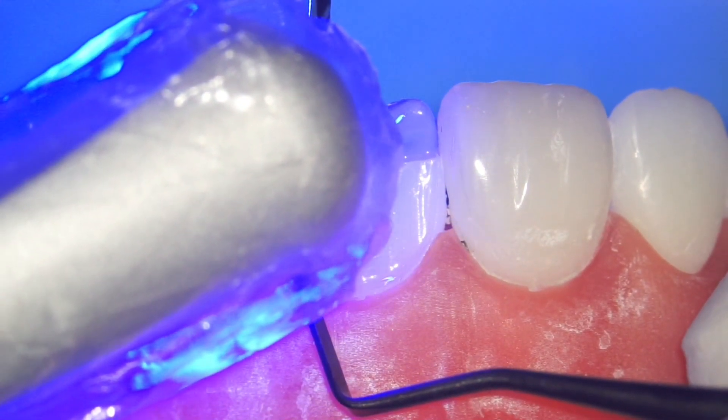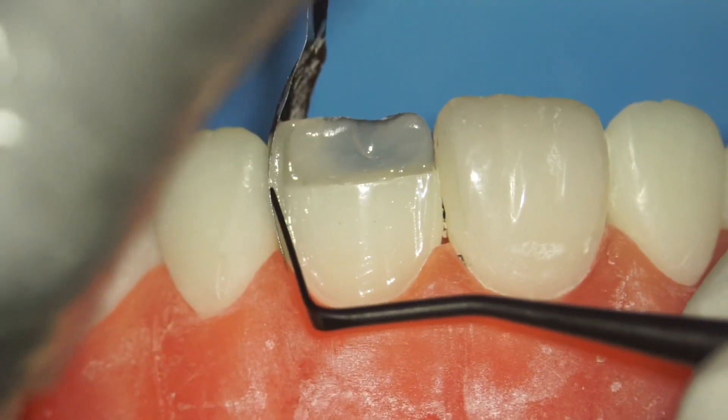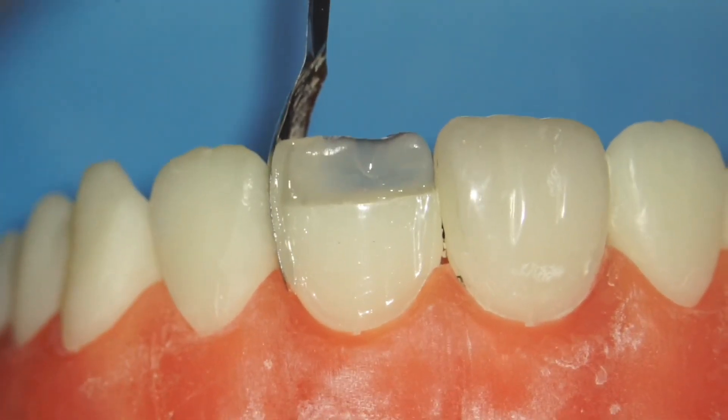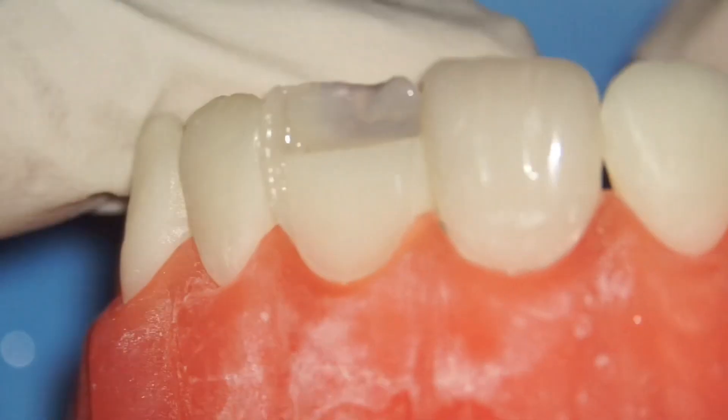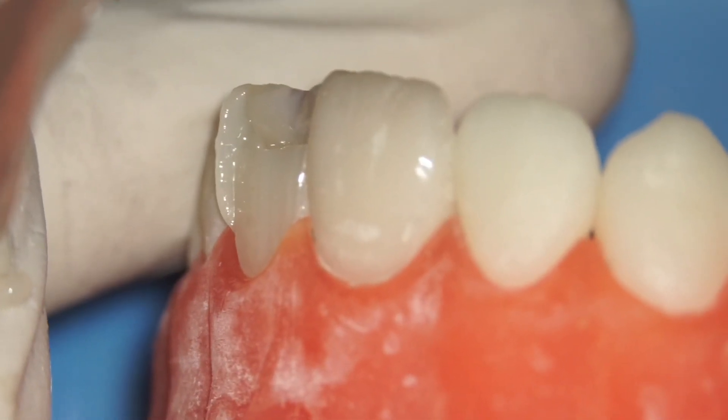After curing, place your plastic filling instrument and release the matrix before pulling it out. From the side you can see the wall is slightly more than what I want — that's fine for demonstration purposes.